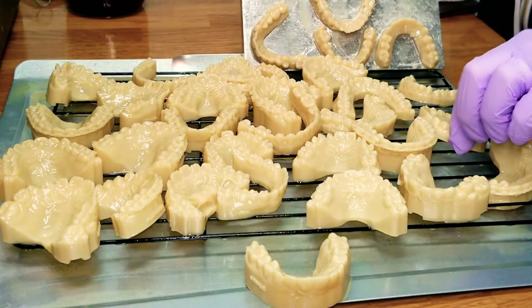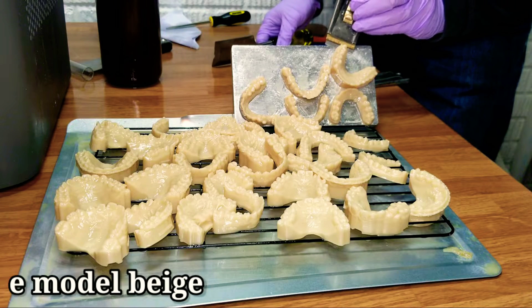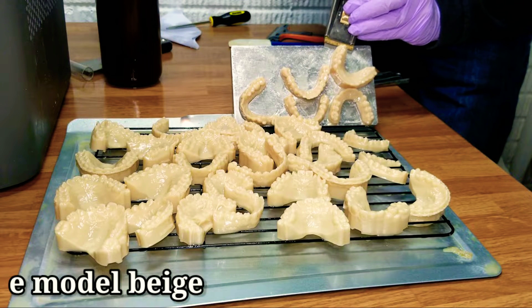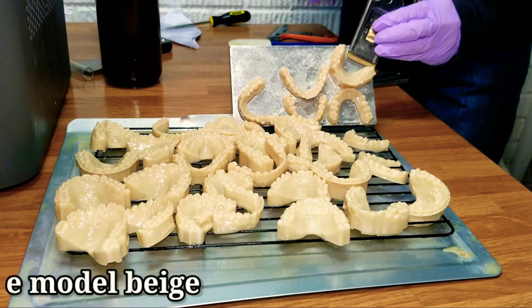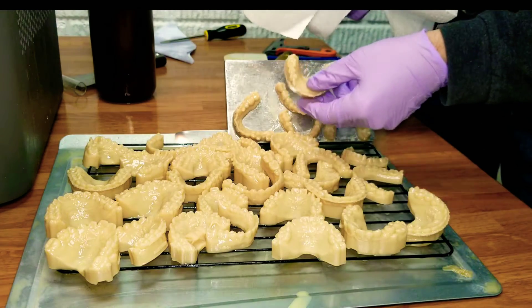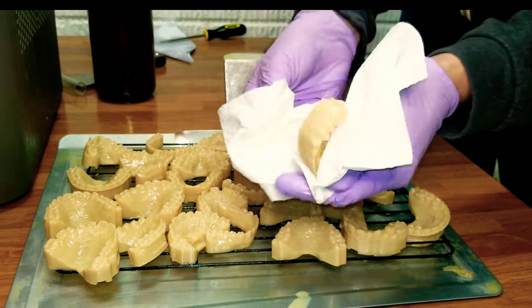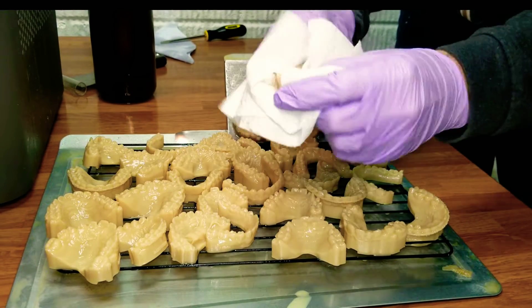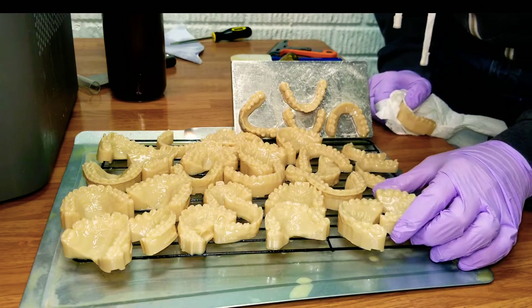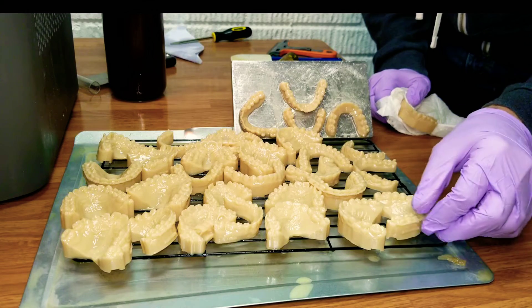In this example we're going to be using prints that were made with e-model beige. First thing we do is go ahead and remove these from the plate. You have two options: you can take a model directly from the build plate and give it a quick dry with a paper towel just to wipe off excess resin and then you're ready to move on. If you have time, you can just put them on a rack and let the resin drip off.